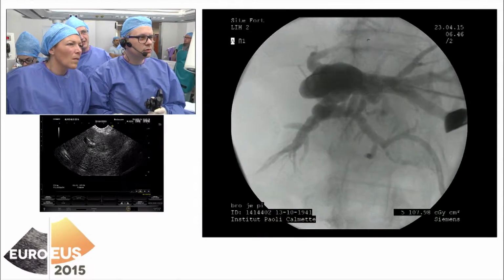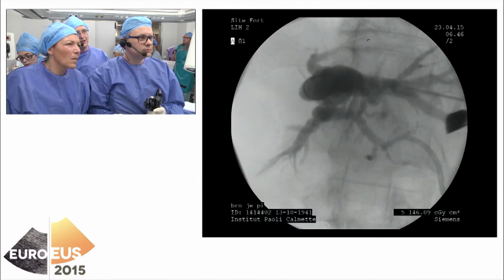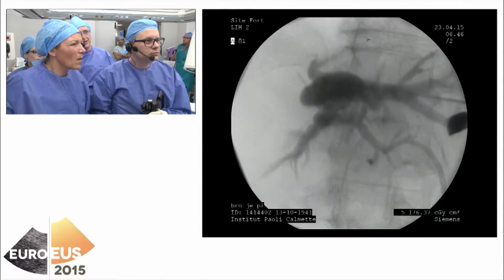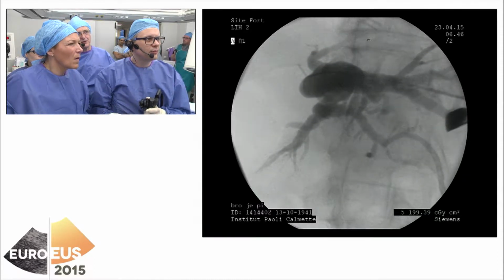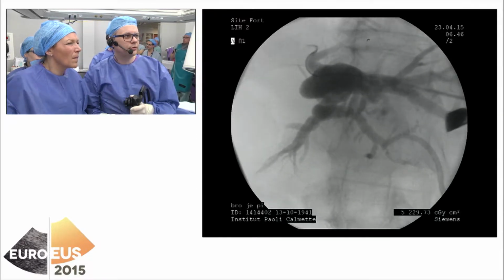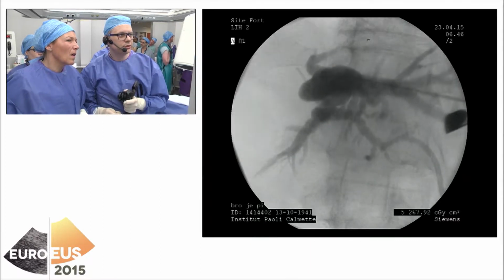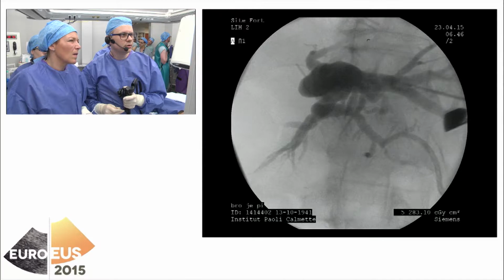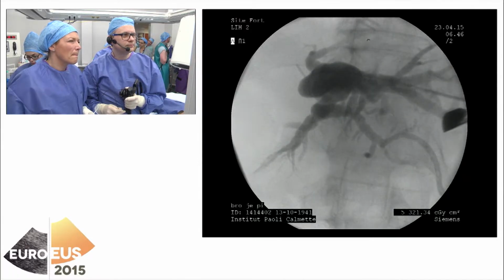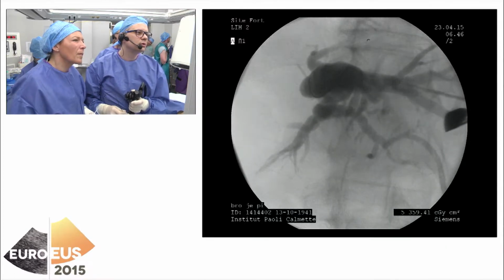And if we think that the communication might be a very small orifice which is in a place that you see where the tip of the cystotome is on the left side of your screen, it can be everywhere because the anatomy having been distorted, we have more tendency to go to the dilated side branch than to go to this small orifice. And I'm afraid that restoring the anatomy in a first step will be difficult.